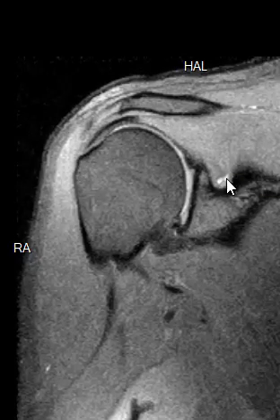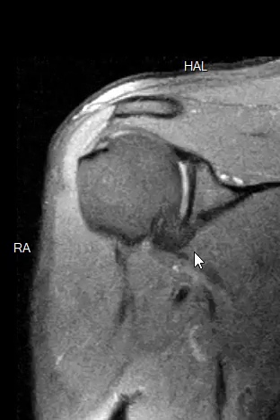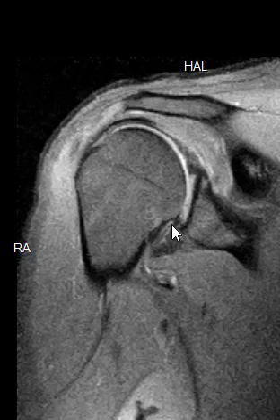Now we're going to look at the labrum again — that little cartilage ring. Here's the top of the labrum and it looks good. If we go down towards the front, it's hard to see on this view, but we have another view we can see it better. And here's the bottom — the bottom looks unusual right here.